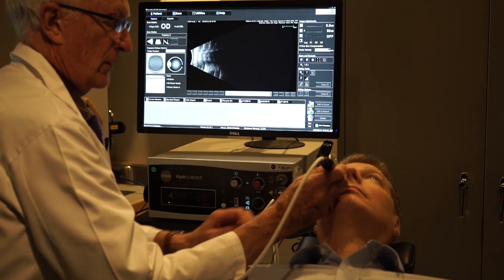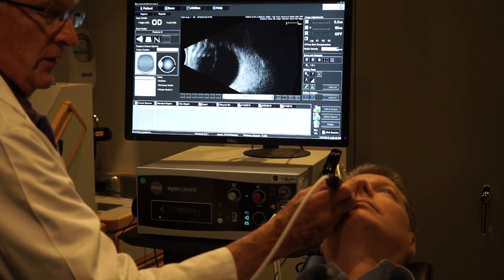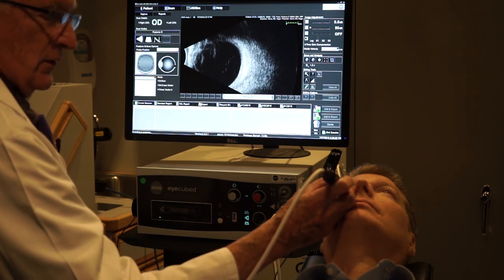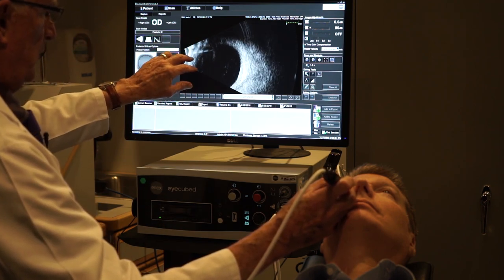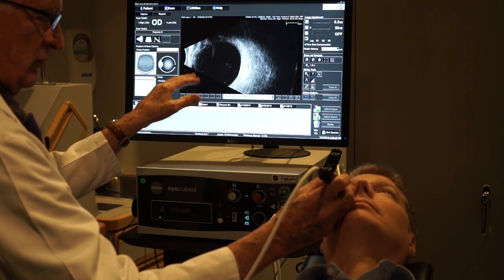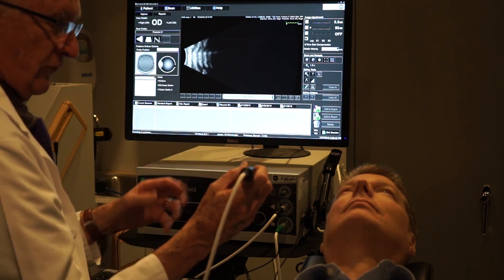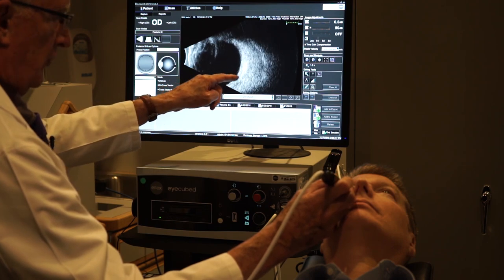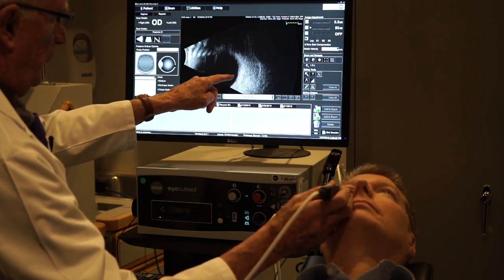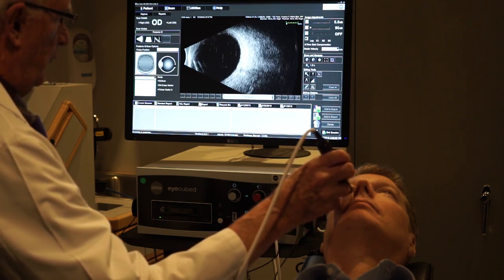I'm placing the probe inferiorly at the six o'clock limbus with the mark towards the nose — this is a transverse probe position. The screen shows the retina at the back of the eye and the front of the eye. In this contact technique we lose information at the front of the eye; the cornea and anterior chamber are meshed together in the initial signal. I can gradually angle the probe like a lever, going further peripherally towards the pars plana, or back towards the posterior pole.